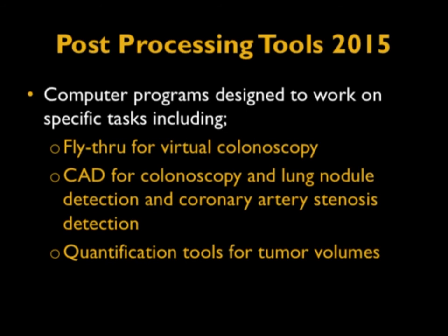Virtual colonoscopy would not exist without fly-throughs and computer assessment. CAD really improves our ability, so CAD is built into virtual colonoscopy. And we look at CAD now for lung nodules, perhaps in coronary artery stenosis, and I've seen articles on pulmonary emboli. So we are developing lots of tools, and in oncology, volumetrics, looking at growth patterns, all sorts of different things.